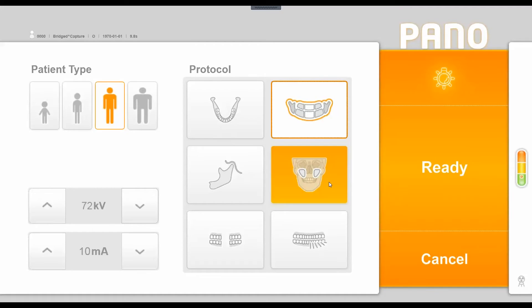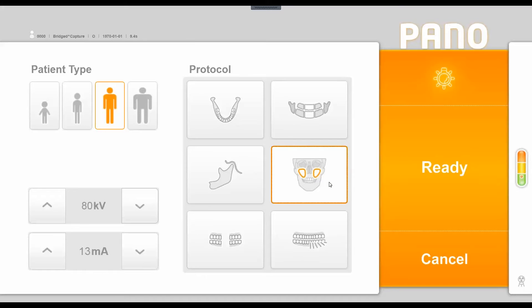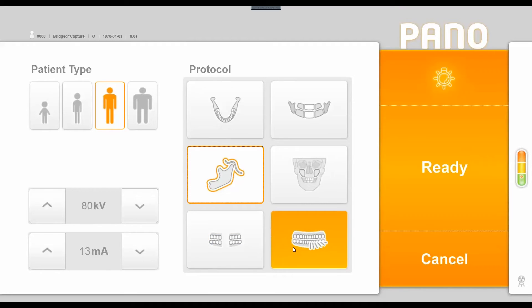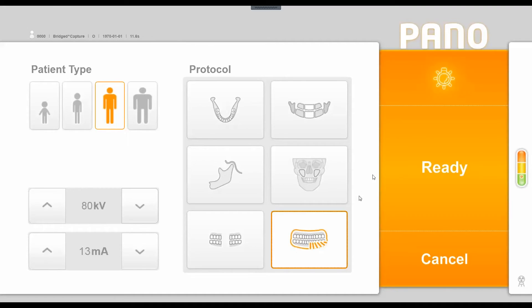Below the segmented pan option is a 2D sinus shot, which requires a slightly different chin rest and positioning. To the left is a 2D TMJ acquisition allowing one or two rotations around the patient — two rotations capture each joint open and closed side by side. There is also an external bitewing option and an orthogonal pan, which makes a slightly slower rotation to reduce overlap, though it does not capture the full TMJ. The orange section lets you toggle positioning lasers, set a ready position, or cancel.